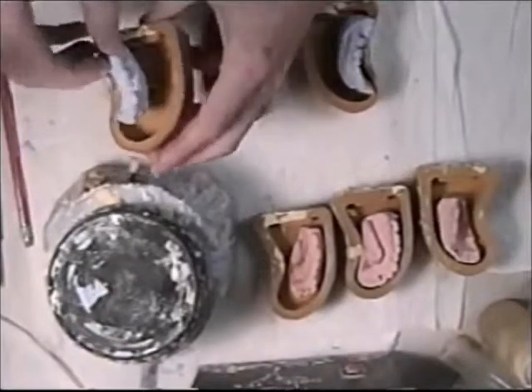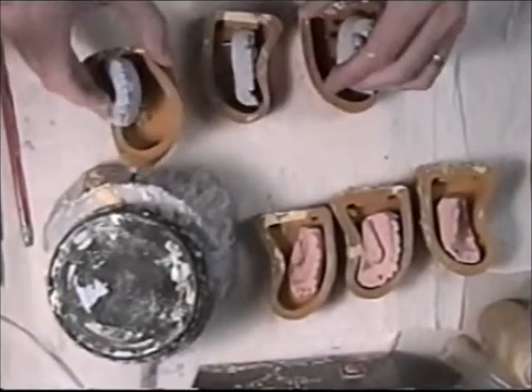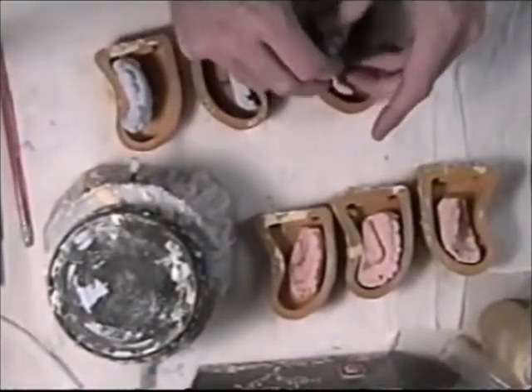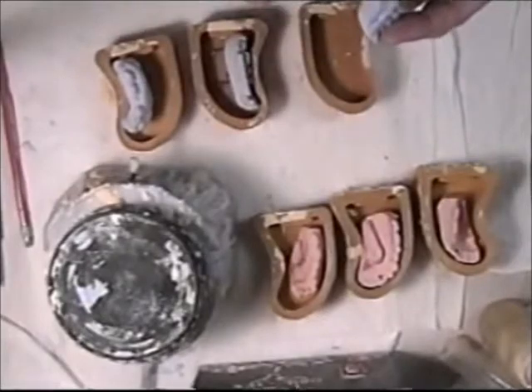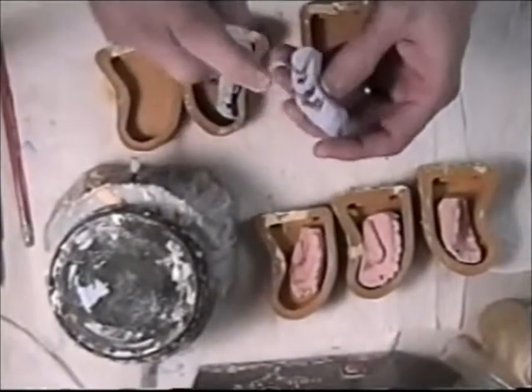I've picked out the rubber molds for each model. The opposing are here and the die models are here. Now I spray the die models only with some de-bubblizer.